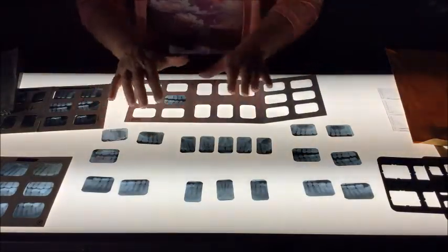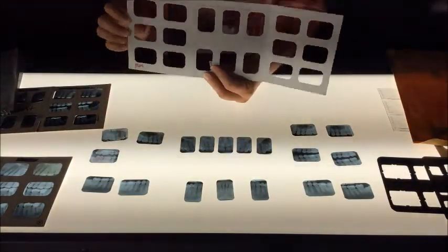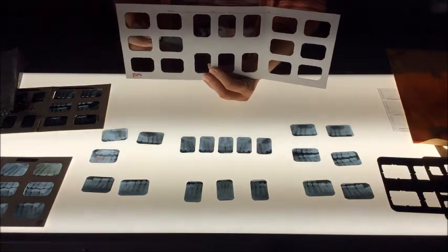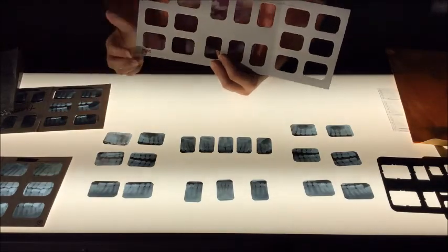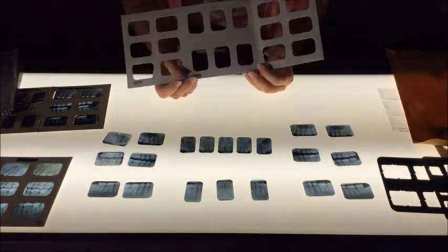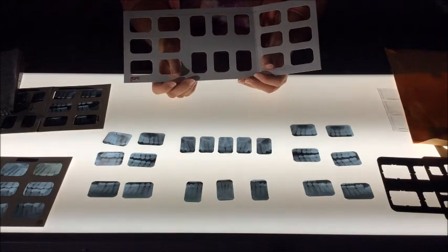This gives you a demonstration of film mounting and an orientation to film mounting. Further tips and suggestions will be provided to you by your book, Chapter 28, as well as your lab instructor.